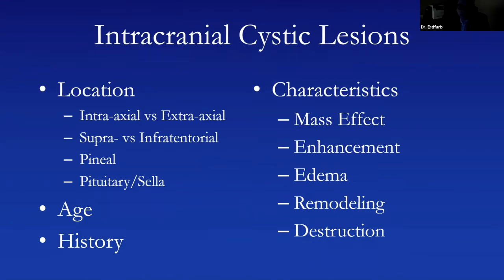So obviously, the big picture is that whenever you're trying to classify any intracranial mass, there are certain things you have to do, because the inherent limitations of CT and MR are that we can see densities on CT, signal characteristics on MR, and enhancement, but a lot of pathologies really do look the same. But if they're in a specific place, it helps us out considerably.